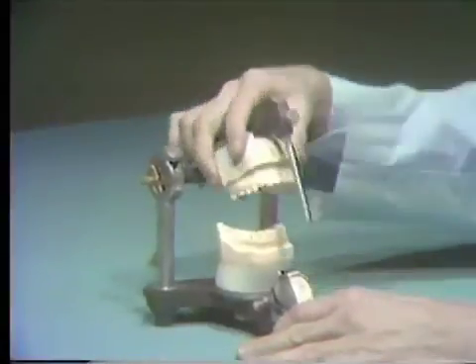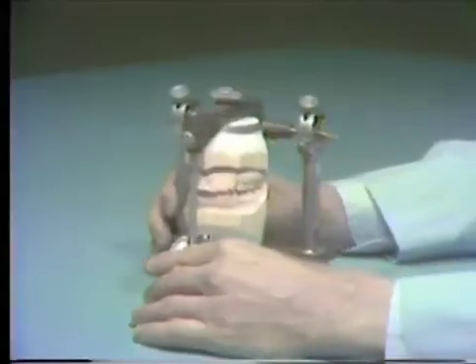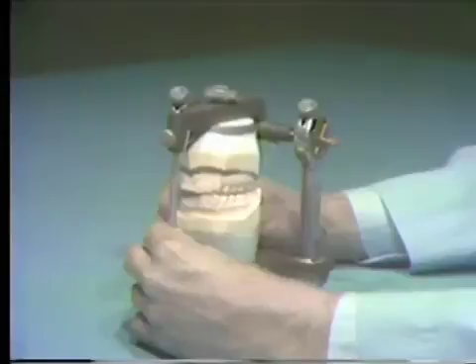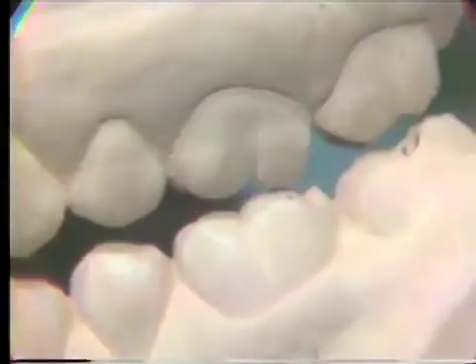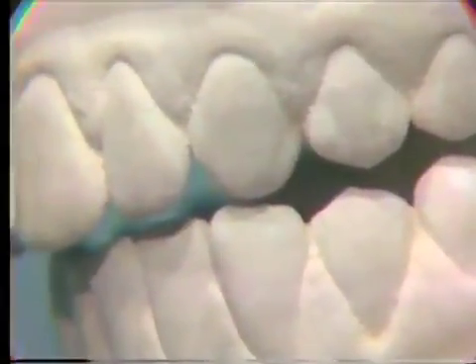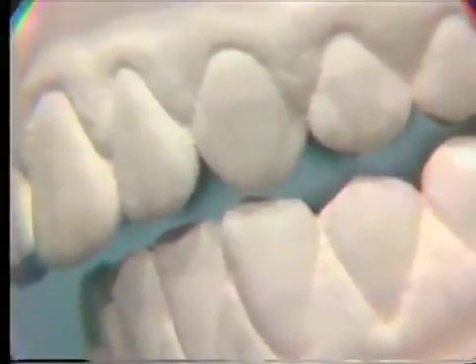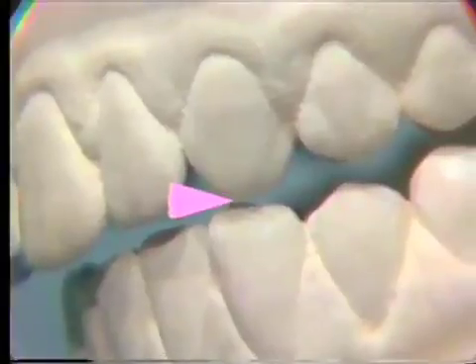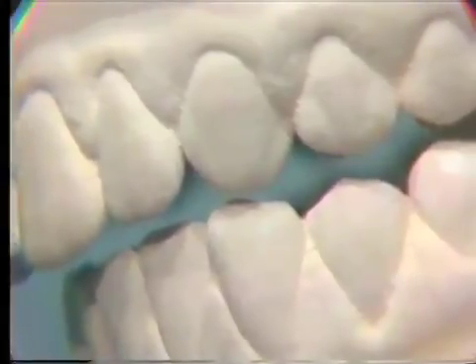There are no interferences in balancing or protrusion. Checking the left working movement from the centric relation position, a heavy contact between the first molars is now present. This contact is heavier in CR than CO because the mandible has been moved posteriorly. This contact prevents the cuspid from contacting during the left working movement. The interference on the molar should be eliminated by selective grinding, which will result in proper anterior tooth guidance during the left working movement.